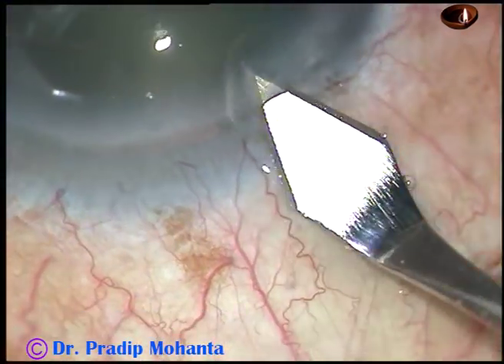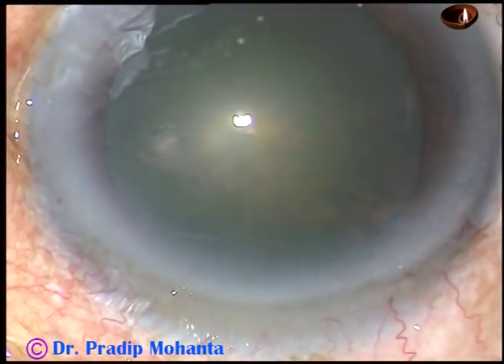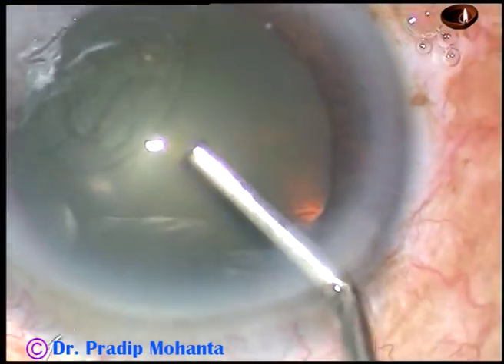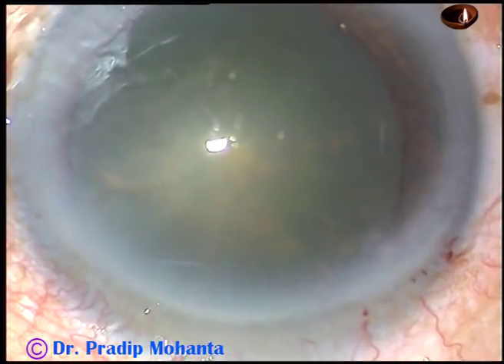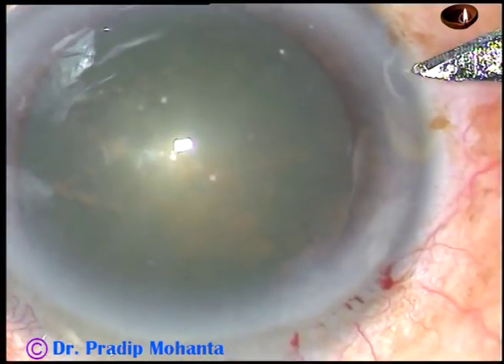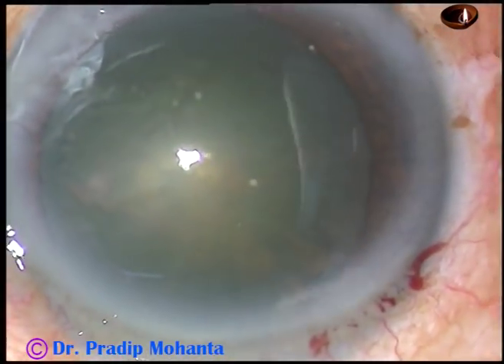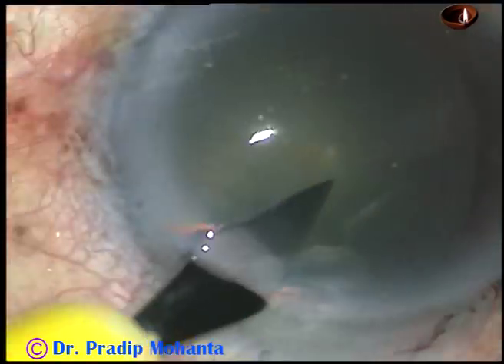This is the main incision at a selected site with a 2.8mm keratome. You can make a side port first, but I usually make the main incision first. Then I inject viscoelastic substance and then the two side ports — this is the one on the left side, the right one has been made.